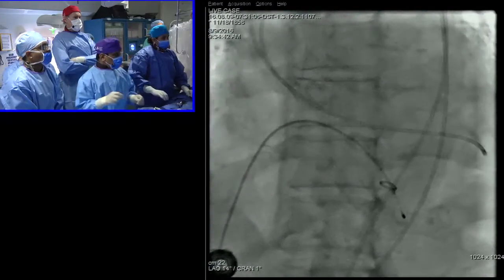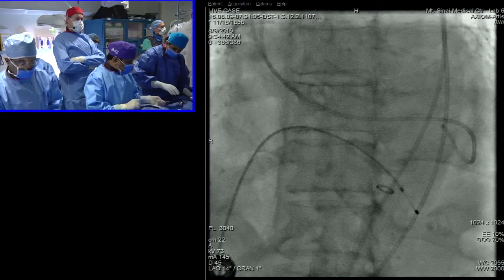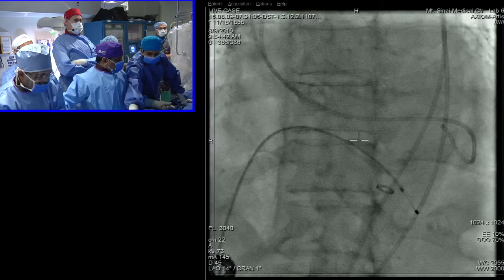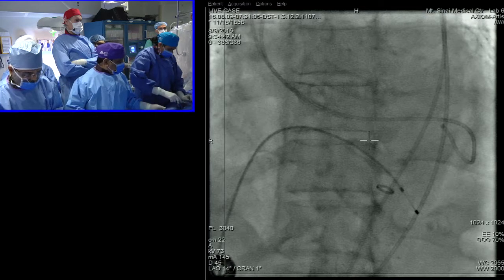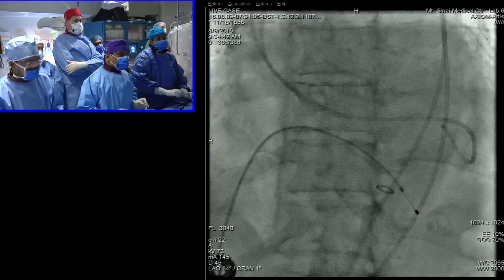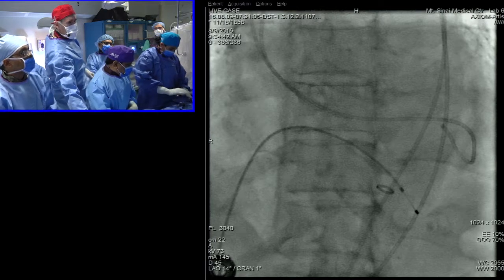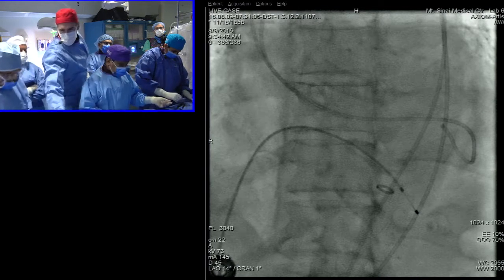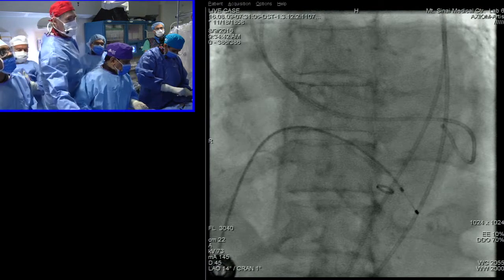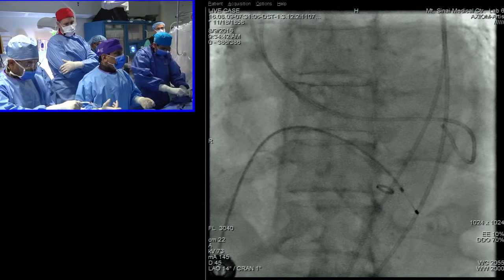Clearly, the issue is a very, very important one. Knowing that TAVR is doing so well clinically for our patients, we're trying to see how we can minimize the steps and trauma, so a no-touch technique type of situation. But then it goes back to asking our echocardiographer what they think. So I really asked Partho earlier, and he gives a great idea, actually, and very predictable, our response to the balloon valve and or advancing the valve.